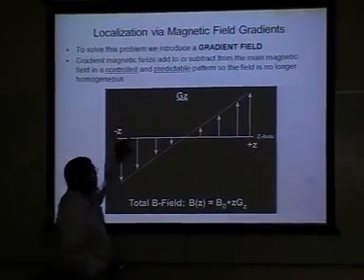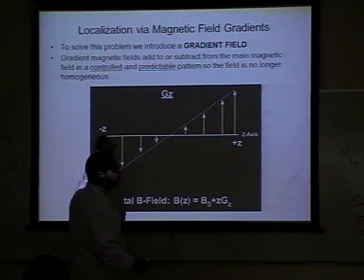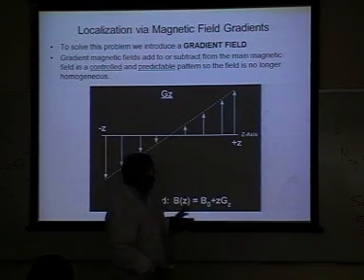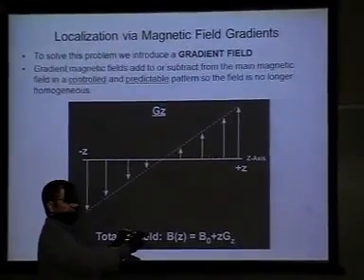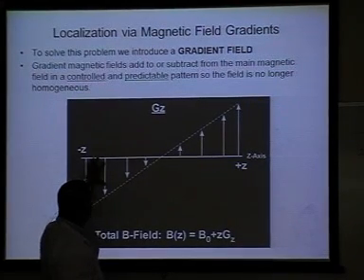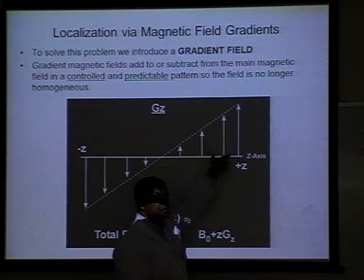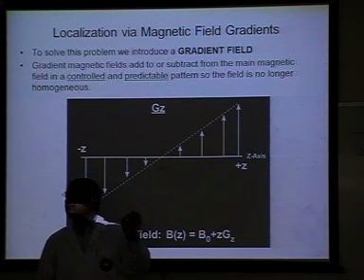Now, this is my B0, the value which is constant, the B0 that I first turned on. Then I have some solenoids or gradient fields that I can introduce: a big gradient here, smaller gradients here, and on the other side, so that I can select where to look.